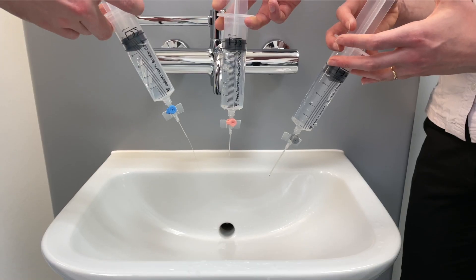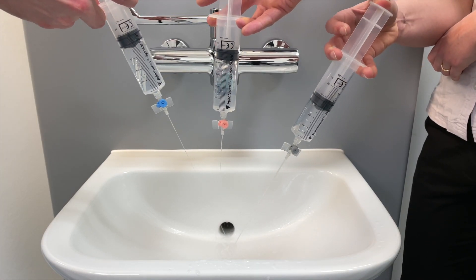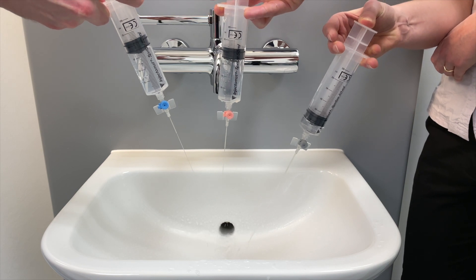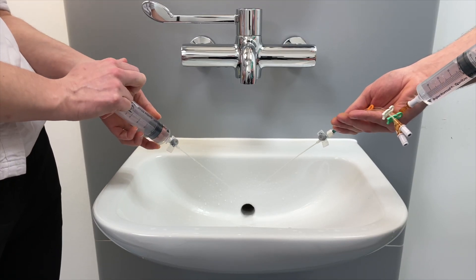If you attach a bionectar or octopus device to a cannula you will limit the flow rate through that cannula. Here you can see the flow rate differences through the different sizes of cannula. However if you add a device like a bionectar or an octopus to a grey cannula you will reduce the flow through that cannula down to the same flow rate as a pink cannula.